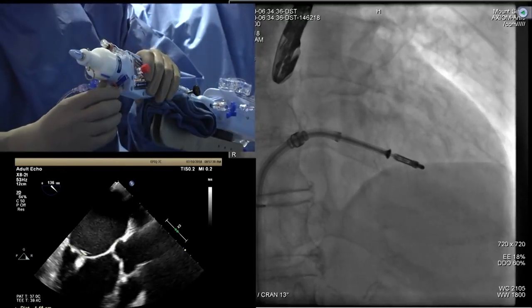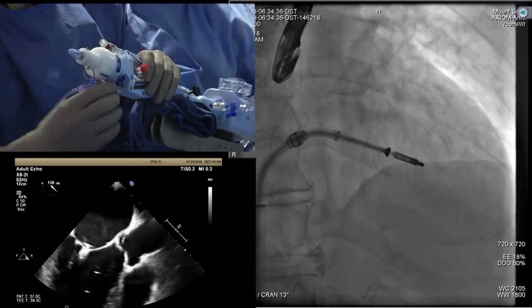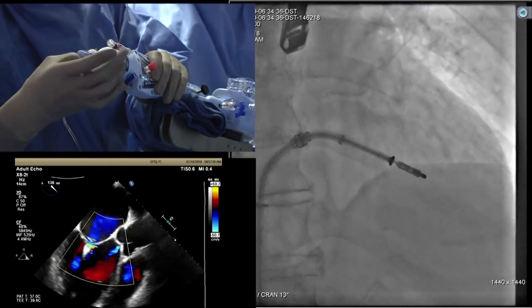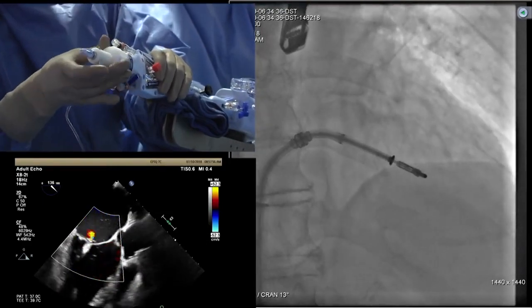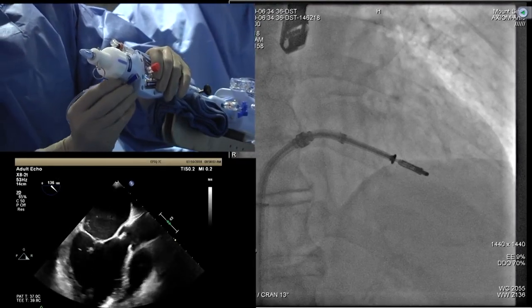So if you see, first thing you'll do is start a flush line. You're going to take the gripper line out. First make sure your release is open, lock and unlock, so that we know it is tight. Nice. So it's tight. Good. Next will be your gripper line. So you take this plastic knob out. Then you have this rubber ring. Take it out.